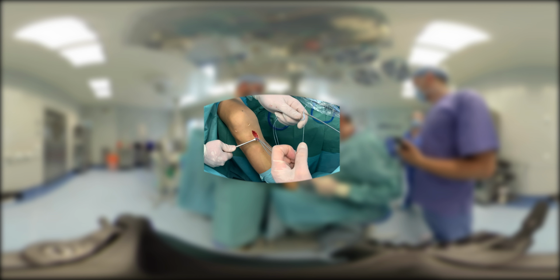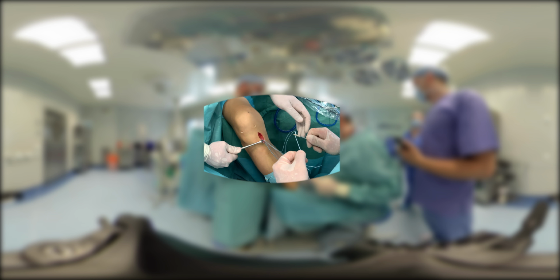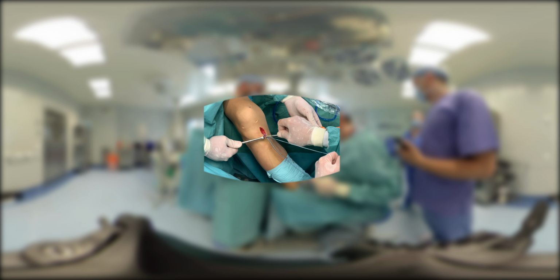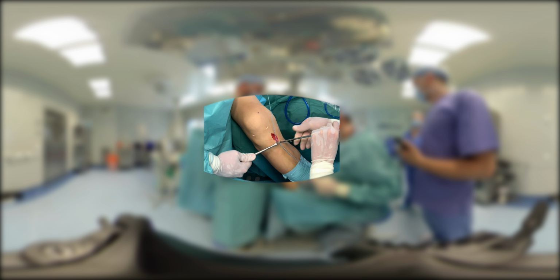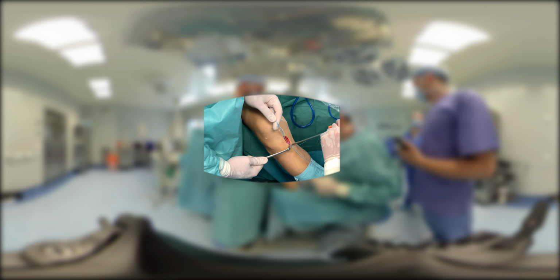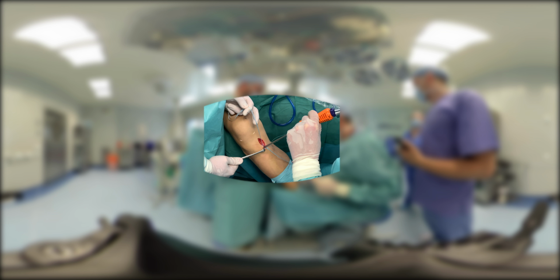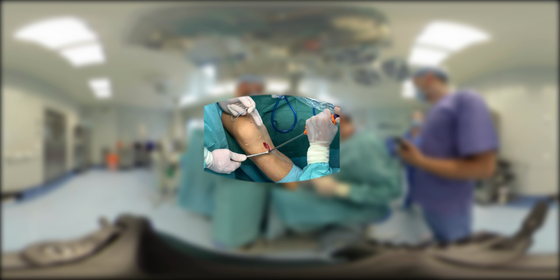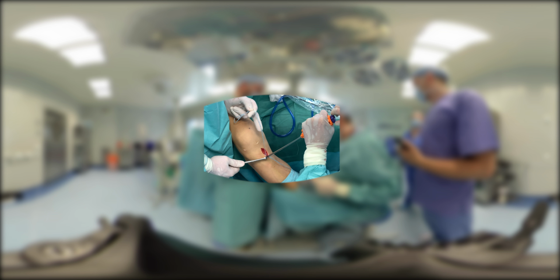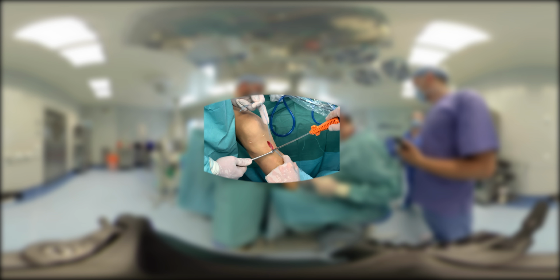We pull the suture through the anchor. Tighten. The assistant controls the tension. Stick the footprint to the bone. And then stabilize it by turning the pressure screw according to the technique.